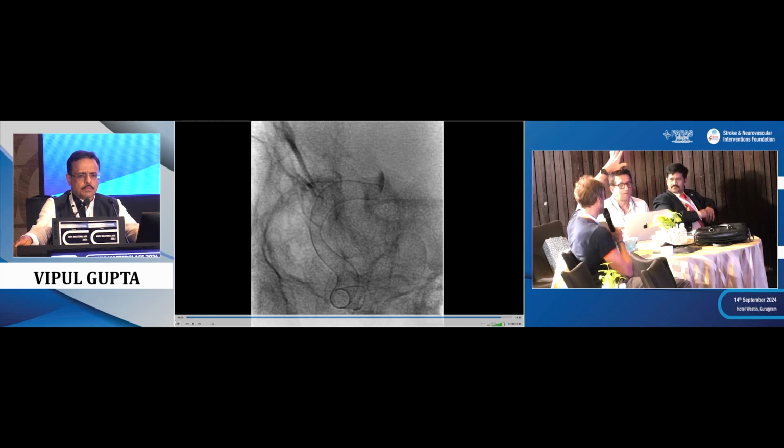the longer it is, the less prone to experience distal fish mouthing you will have, since the stent has time on the distality to spread the difference of force induced in the aneurysm, to make a repartition of this force in the length of the stent, the distality.